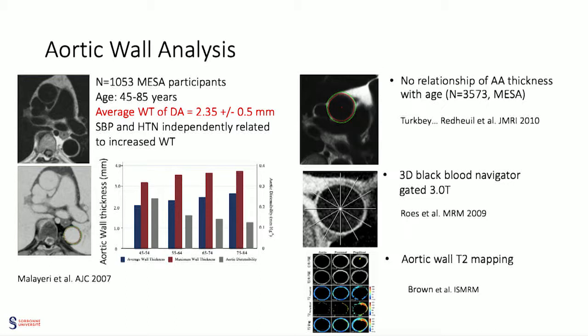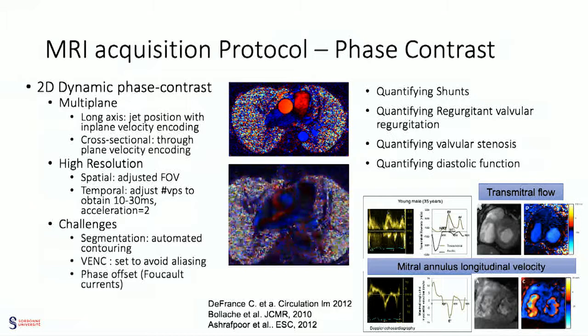And coming to the wall characterization, of course, maybe the T1 and T2 mapping techniques would be interesting. I say would because obviously in very thickened diseases, as we will see, maybe that can be interesting, but with only 2 millimeters, there's huge partial volume effect.